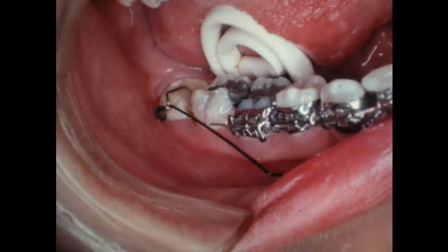And here's the spring. When I activate this, actually this bar would go down this way, and I pulled this up and tied it together, and then just stuck this down in the occlusal surface of that tooth and bonded it onto that. And then I raise this up and put it on the tooth, and then cut this wire that I had it tied in activation, and it turned the spring loose to elevate the tooth. So here it was, and we didn't use the hook fashion that day. I raised this up and laid the wire right into the tops of the brackets and kind of held it on there. And then cut this, and it takes that tooth right out of that hole.